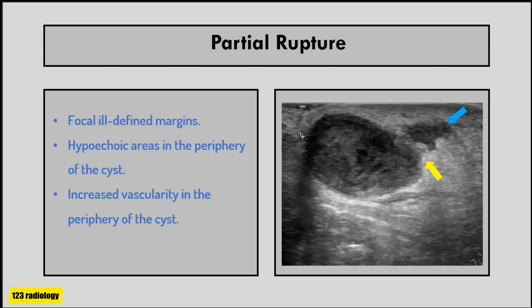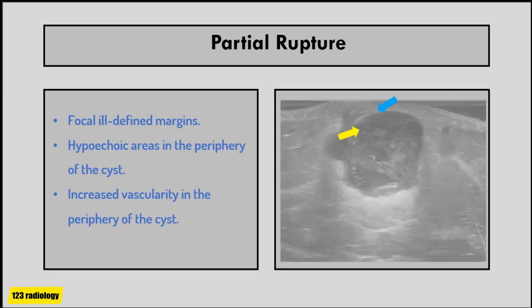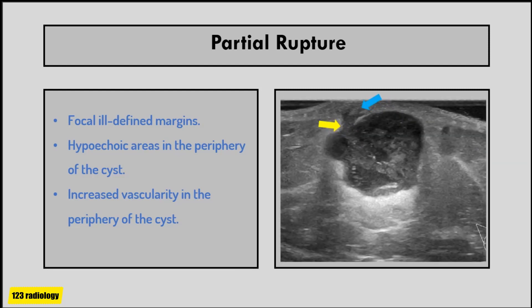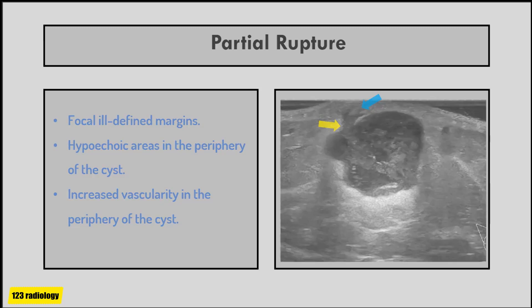Color Doppler examination shows increased blood flow in the periphery of the cyst, frequently low flow. Another case of partial rupture of an epidermoid cyst in the breast: the yellow arrow points to the focal wall disruption and the blue arrow points to the leaked hypoechoic content outside the cyst.